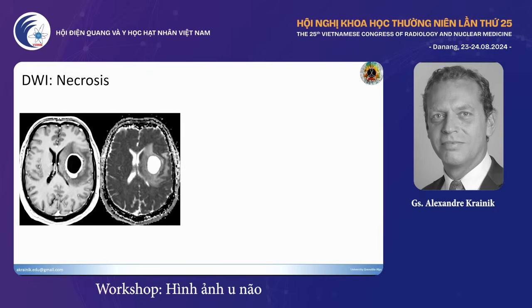Okay, and when you look at the necrosis, this is different, we forget the tissular part. You're trying to estimate how fluid this liquid is, and here you see a ring-enhancing lesion with some liquid inside, and when you do ADC, you see the ADC of this liquid is the same as CSF, so very fluid, typical of a tumoral necrosis.